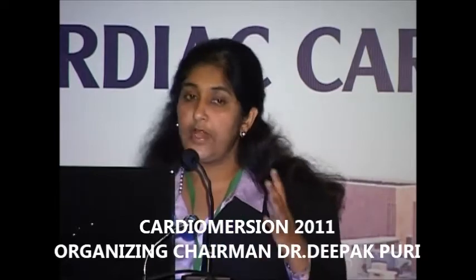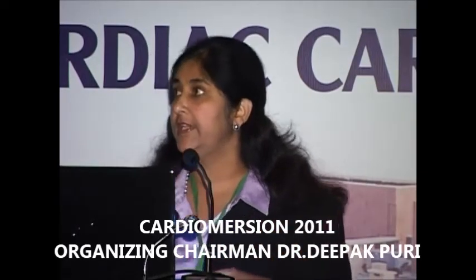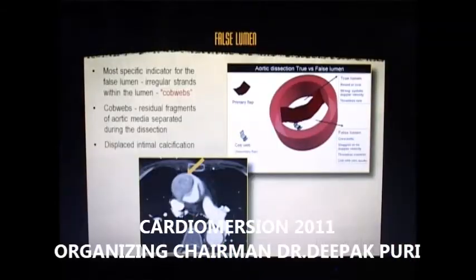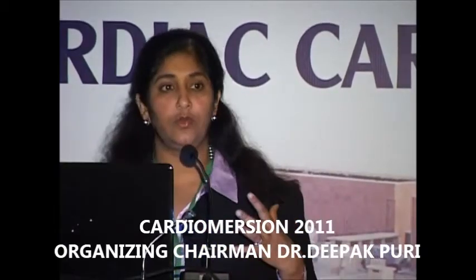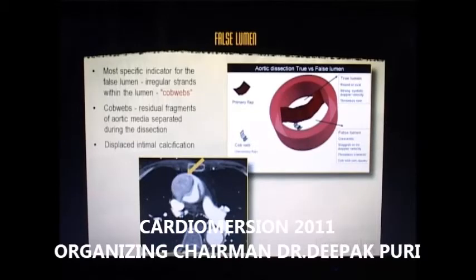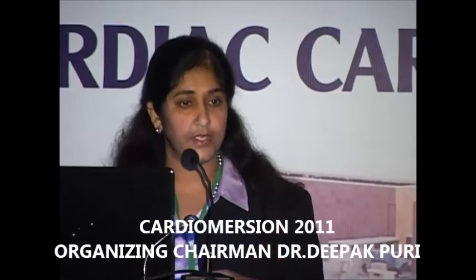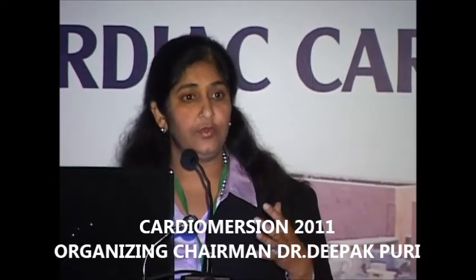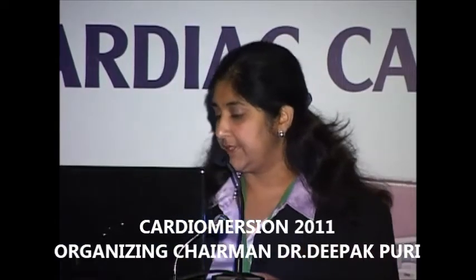One of the very specific signs for detecting the false lumen is to be able to see cobwebs. Now, what are cobwebs? These are residual fragments of the aortic media that were separated during the dissection. Why do we need to figure out which is the true and the false lumen? Because now we do a lot of endovascular repair rather than open heart surgery, and we definitely do not want to put the graft in the false lumen. We want it in the true lumen, and we want to save the origin of the vessels.